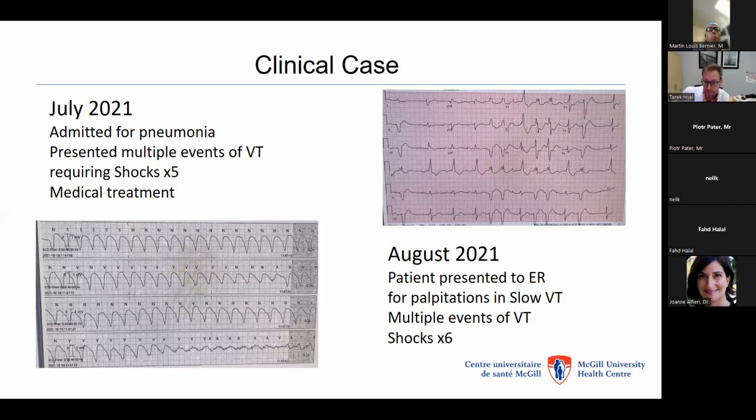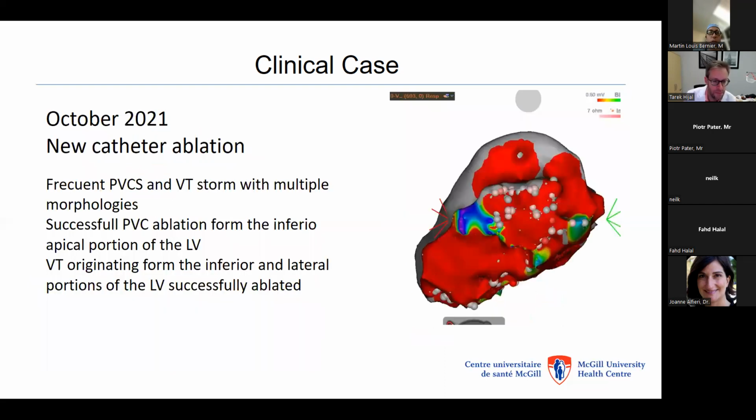Certain patients will have one VT from one discrete area, but many patients, especially as they're further along the way clinically and with severe heart failure, will have several VT morphologies. And I think that was one of the, is there another slide? Yeah, so that was slightly more basal inferior. The lateral wall was targeted, and this was more of an inferior portion. Next slide.